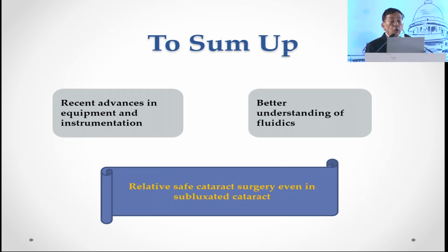So in short, recent advances in equipment and instrumentation and a better understanding of fluidics give relatively safe cataract surgery even in subluxated cataracts. Thank you.